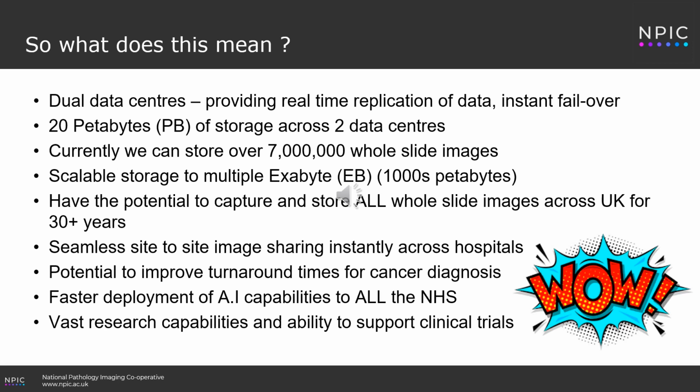We also have the potential to capture and store all whole slide images across the UK for over 30 years. There's seamless site-to-site image sharing capability. So it means if you're part of the NPIC network, you can instantly access an image that's been scanned in a different hospital. There's potential to improve turnaround times for cancer diagnosis.